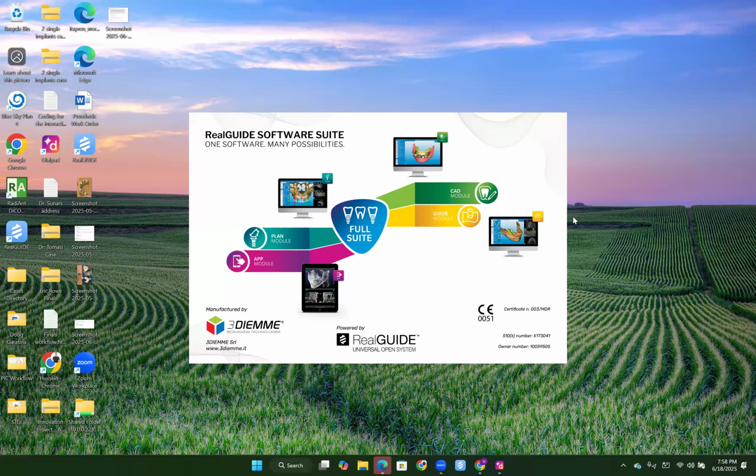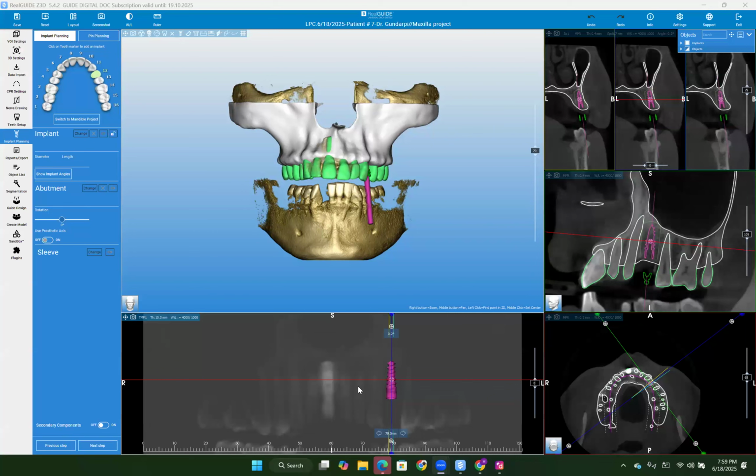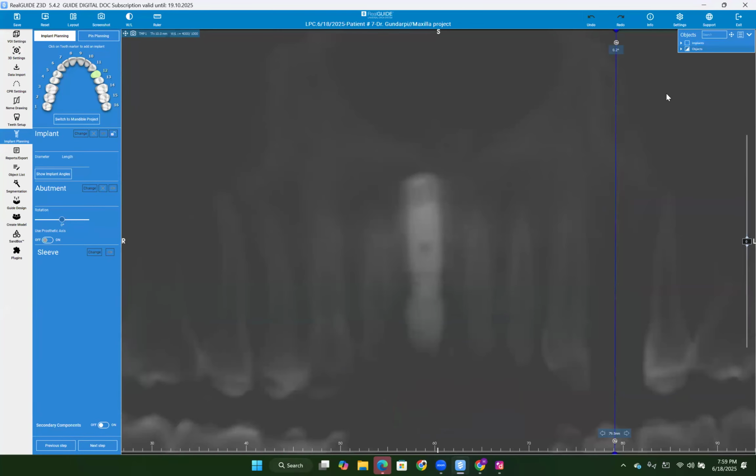It's a consult for a single implant on tooth number 12. As far as medical history, he has a history of high blood pressure and he's taking medications. He's HIV positive and he is taking medications. He also has a history of acid reflux. He does have an implant in the upper anterior already. He was missing a tooth on the lower anterior, but there wasn't enough bone to place an implant, so he went with a bridge on the lower anterior. And is he already missing number 12 here? Yes, he extracted it prior to being my patient.